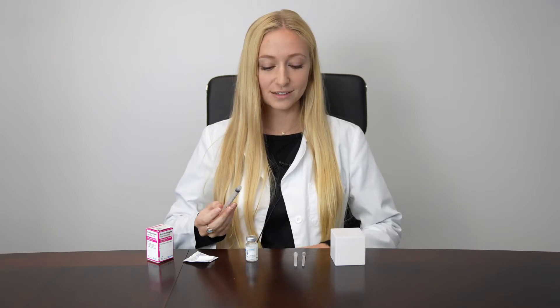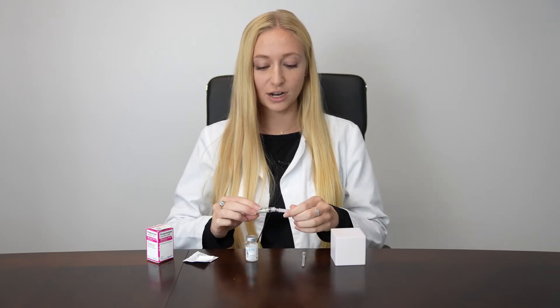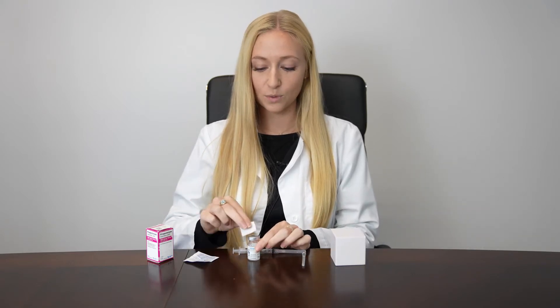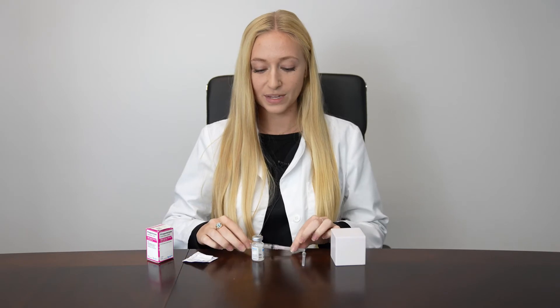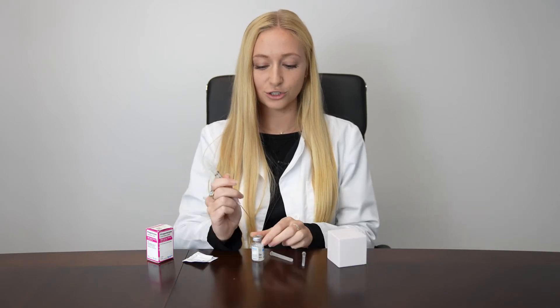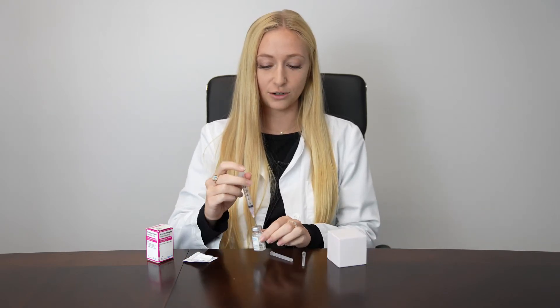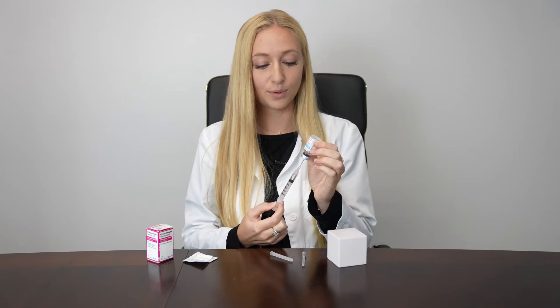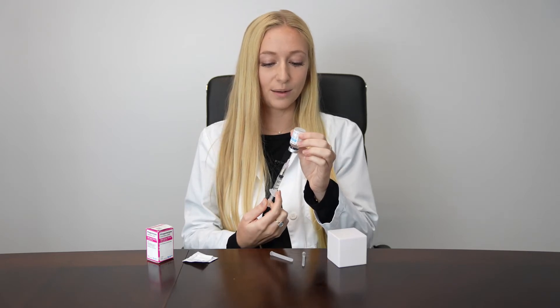After washing your hands, the first step is to attach your 18 gauge 1½ inch mixing needle. Pop off the cap of your vial, wipe the top with an alcohol swab, and then insert your larger 18 gauge 1½ inch needle into your vial of progesterone in oil. Flip it upside down, ensuring that the tip of your needle is submerged within the liquid, and then pull out 1 cc or 1 ml.